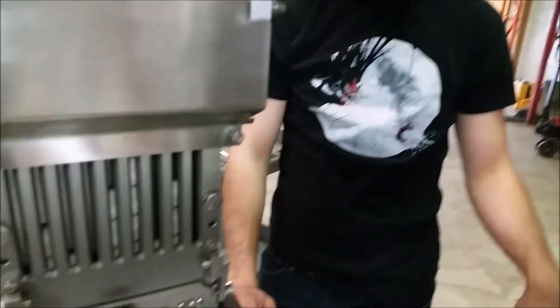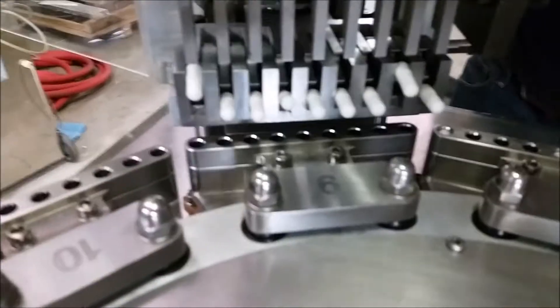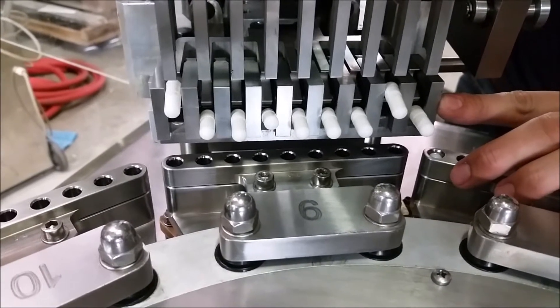The second way you can align the orientation case is using capsules if you don't have your alignment pins. To do that, you want to get everything back in and rotate it to the point that the capsules are about to be rotated into position.